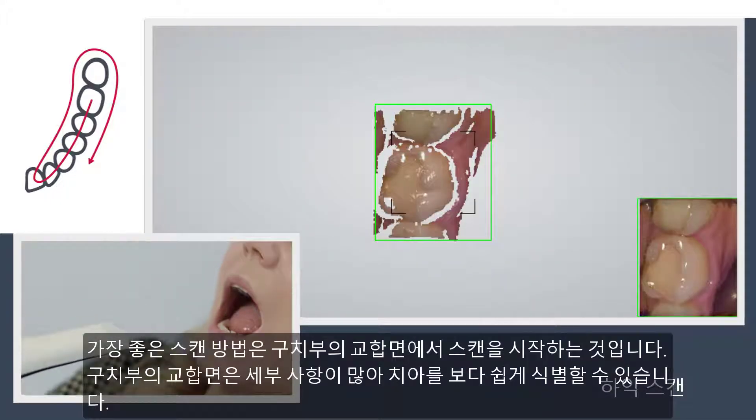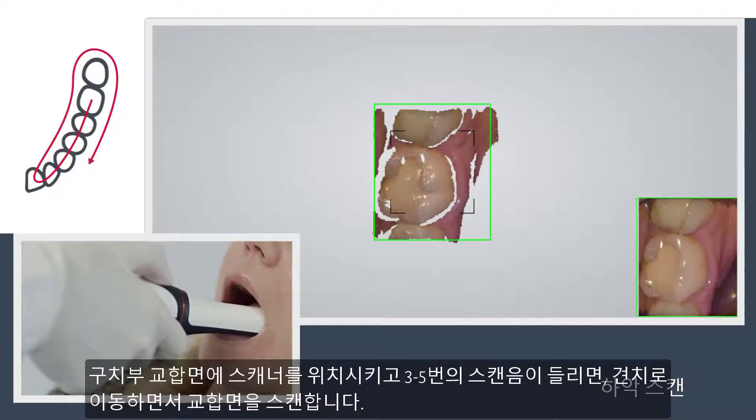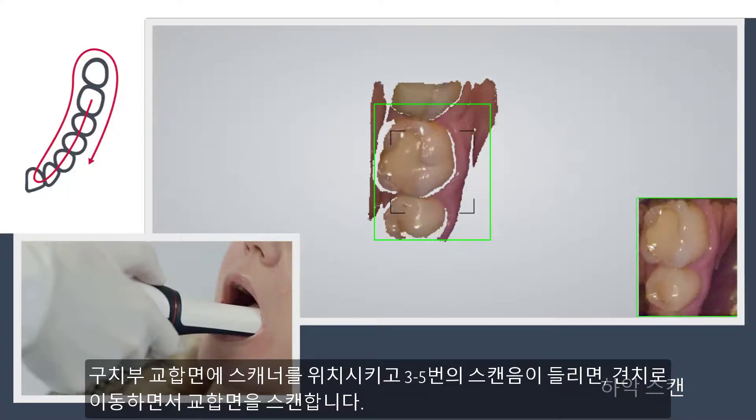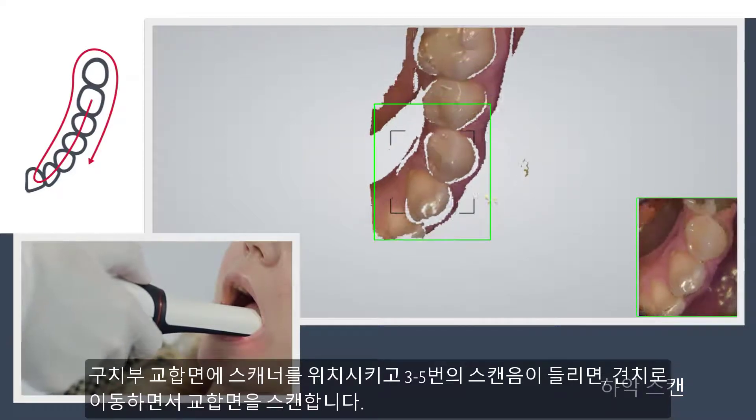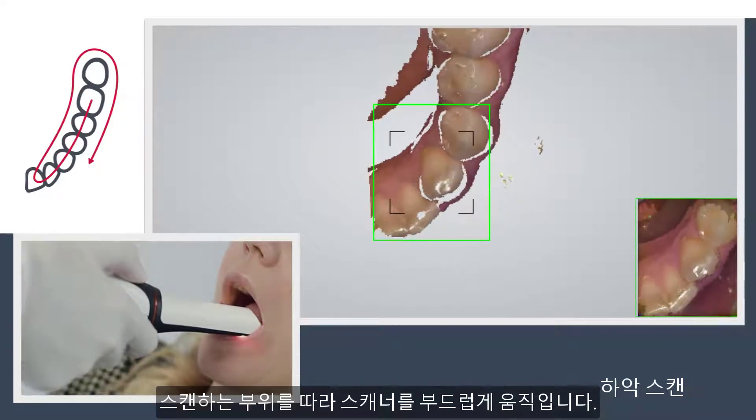The best scanning method is to start with the molar occlusal surface, since it has greater detail for easier identification. Wait three to five clicks, then move towards the K9 while the scanner captures the occlusal surface. Move your scanner smoothly without jumping around.